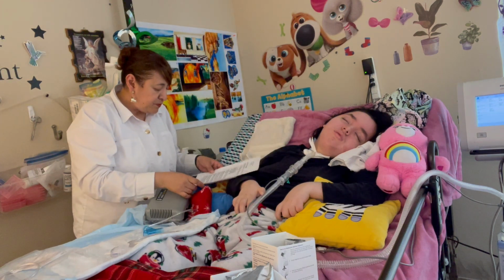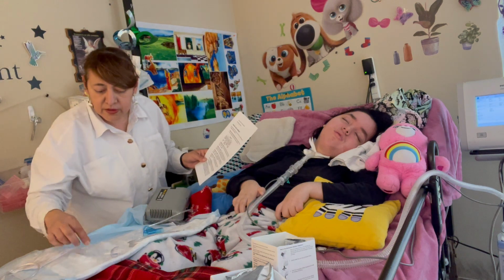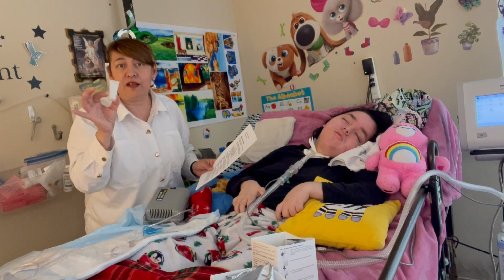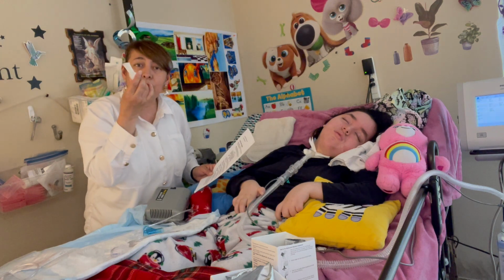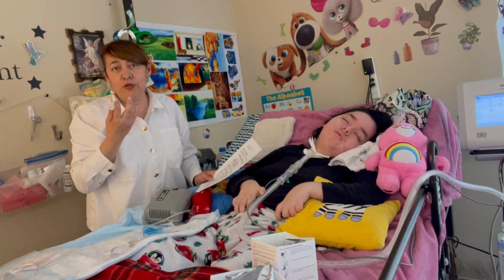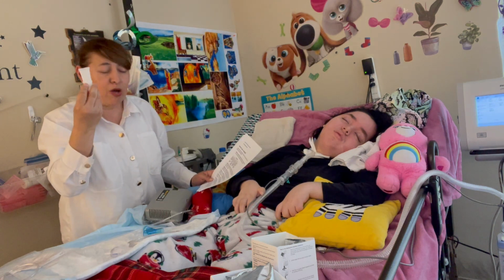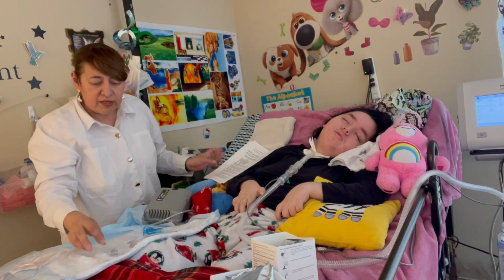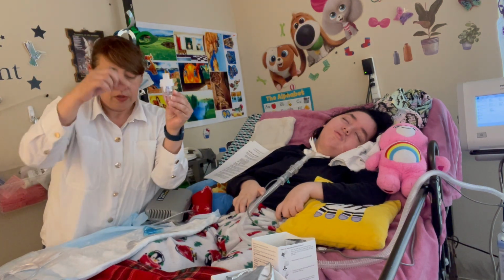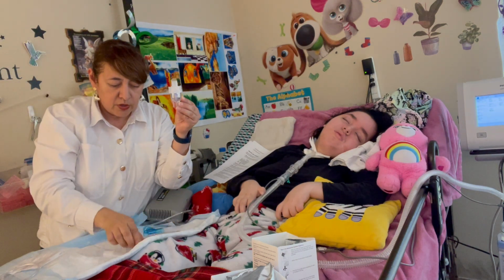Okay. It says here that you can place the mouthpiece. I'm going to explain the names of each item, but this is the mouthpiece. She doesn't use it because she's not able to hold it in her mouth. Okay, so let me introduce you to the piece names. This is the cup. You pour the medication into the cup.